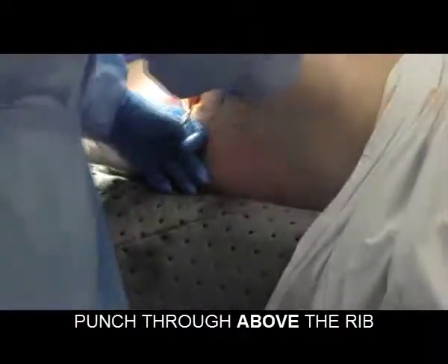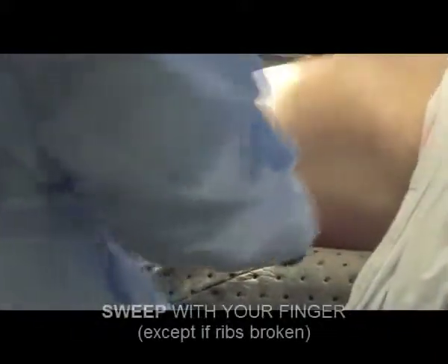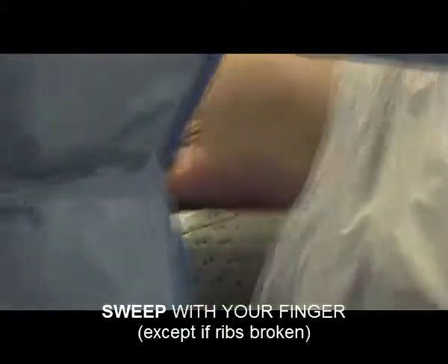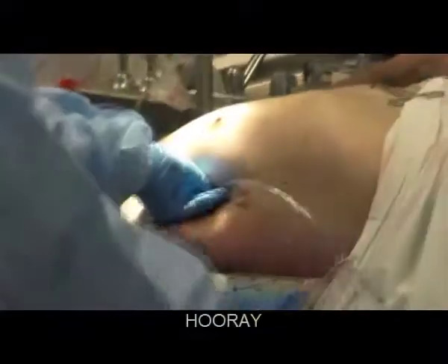Open up. I lost the space, but I can actually feel where my finger is. I made a huge space, so that worked out nicely. And you're in the chest.